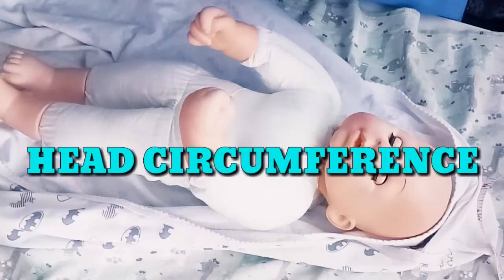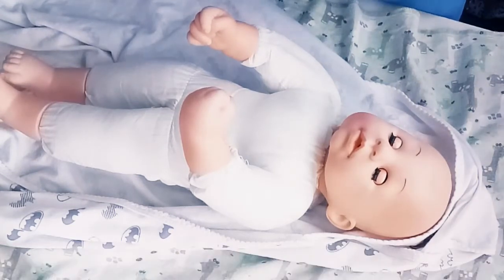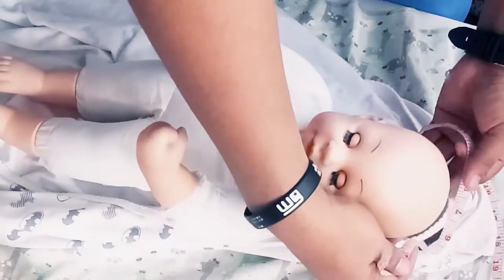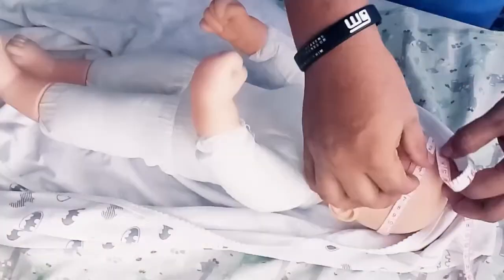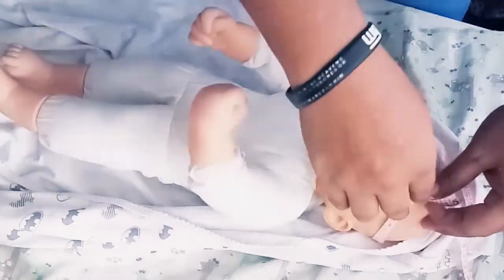To measure head circumference, we're going to need a measuring tape and we measure in centimeters. A normal head circumference in an infant is about 33 to 38 centimeters. Place the tape measure around the largest diameter of the head — a little bit above the eyebrows — then wrap it around and place it around the most prominent part of the head. Gently lift the head and put the measuring tape behind, then pull it around. The head circumference of the infant is about 33 centimeters.